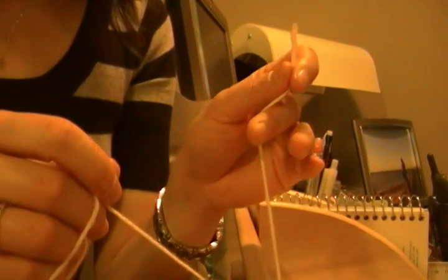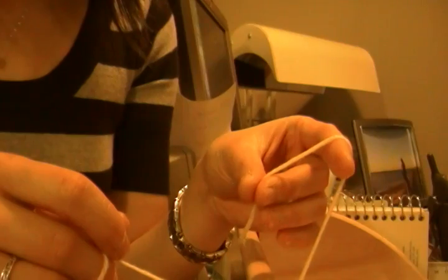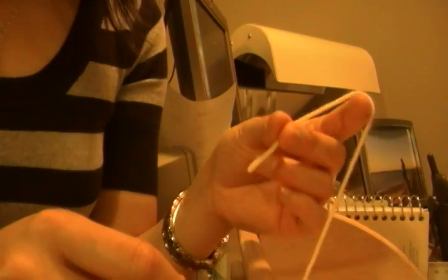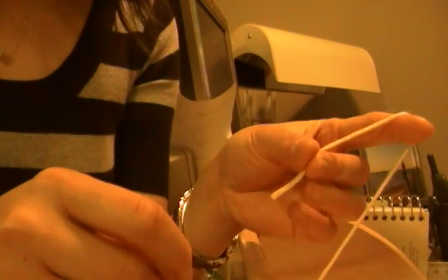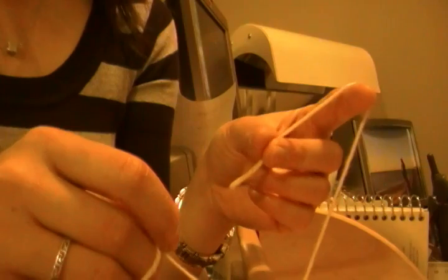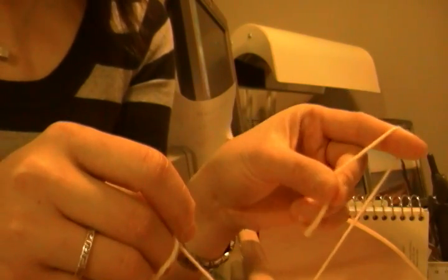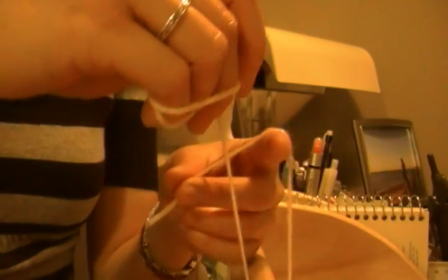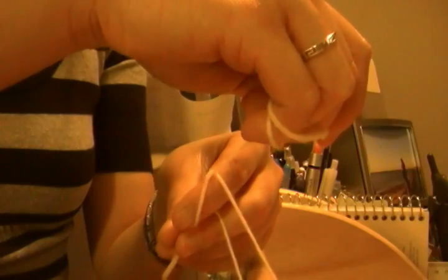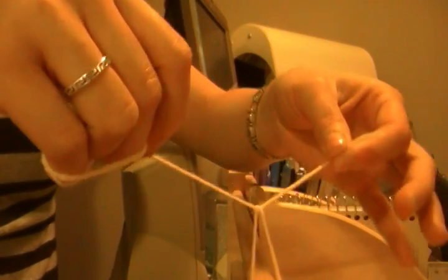My left hand is going to be the one doing the work. I'm holding the suture with my left hand like this, and my thumb and my third finger are holding it, and it's looped around my index finger. I'm keeping the orientation with the end of the suture facing me, and keeping the suture as close to the tip of my fingers as possible. I'm just going to loop it around my index finger like that, and then bring my index finger through like that and bring it around the hole.